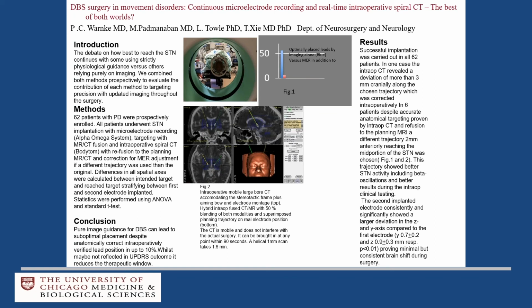We still did not take the correct anatomical CT-guided approach with verification, because physiologically we got a better result from another trajectory based on the microelectrode recordings. So having both is actually the best of both worlds.